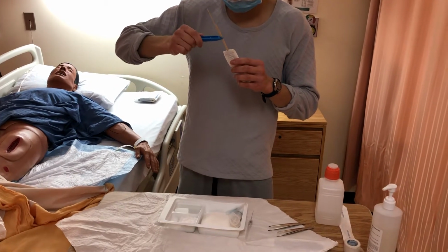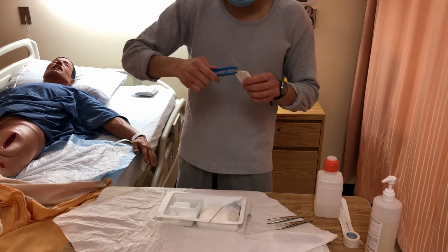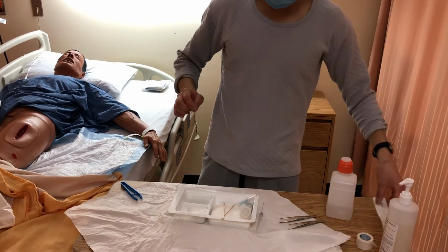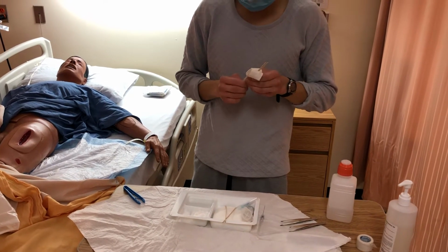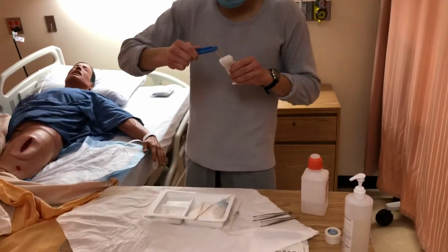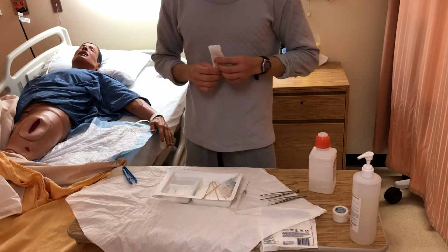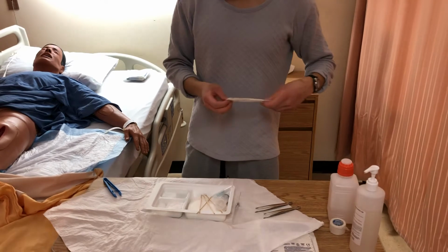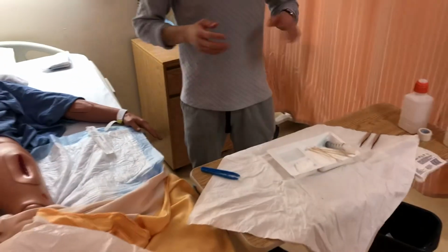And I'm going to expose the dressing. And lastly, I'm going to get another set of cotton sticks. And I'll do hand hygiene, and I'm going to put on my clean gloves. And I'm going to keep this as a measuring reference right here. And now I have everything in my field.